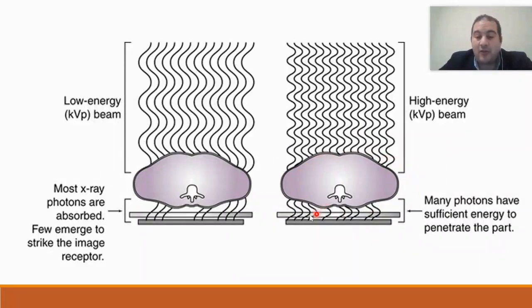If these materials are present in contrast to the background and the surrounding tissue, and I apply specific parameters or settings, you will observe a distinct difference in the results. This is because the parameters are tailored to enhance the visibility and differentiation of high-density materials, making them stand out more prominently against less dense backgrounds.